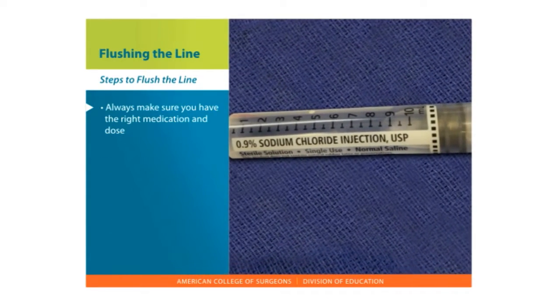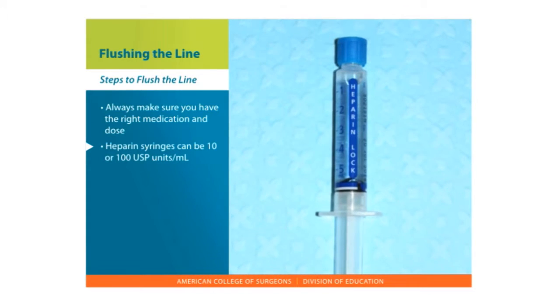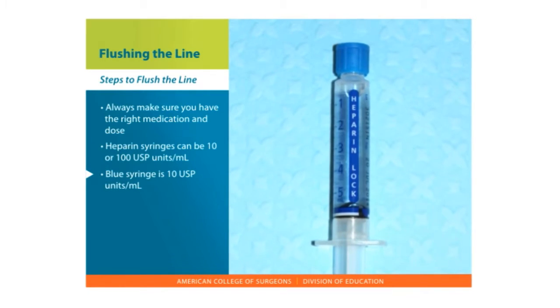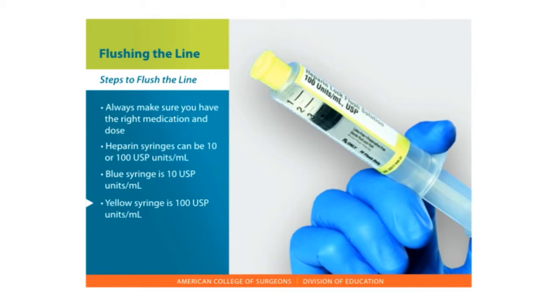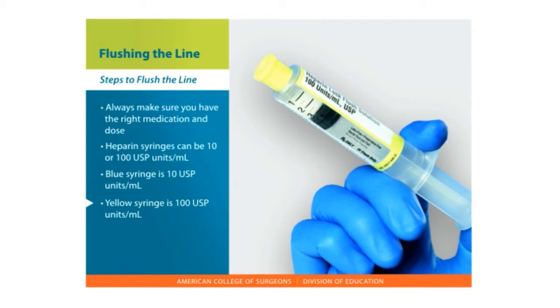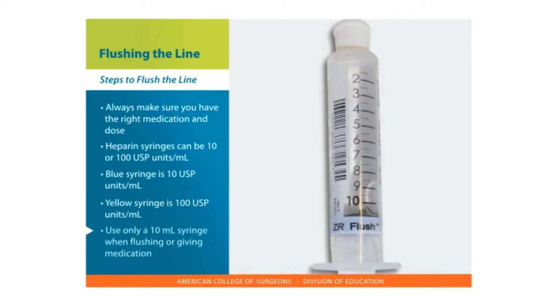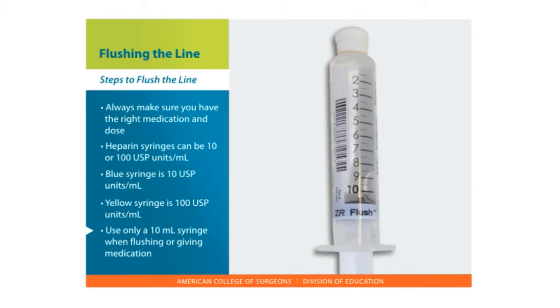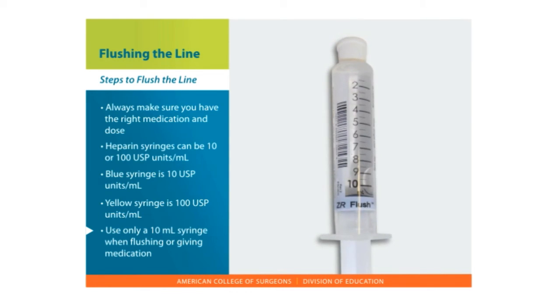Remember to always check to make sure you have the right medication and right dose. Heparin syringes can be 10 or 100 USP units per milliliter. The blue syringe is 10 USP units per milliliter and will be used for routine flushing. The yellow syringe is 100 USP units per milliliter and will be used when the CVAD will not be used frequently. Also check the syringe size. Use only a 10 milliliter syringe when flushing or giving medications. This will prevent excess pressure on the CVAD. You will repeat these steps for each CVAD lumen.